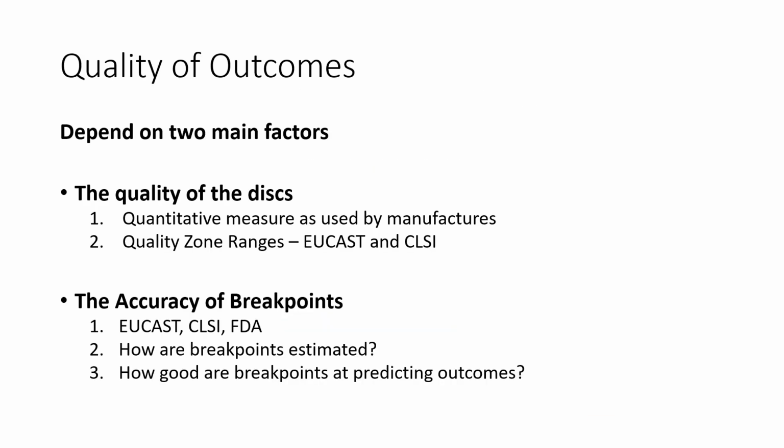Of course, what is important is the outcomes, and when these tests are carried out, the outcomes depend on two main factors. One, the main factor is the quality of the discs themselves, and once the plate has been read, it then depends very much on the accuracy of the breakpoints. And I'll be looking at each of these separately.